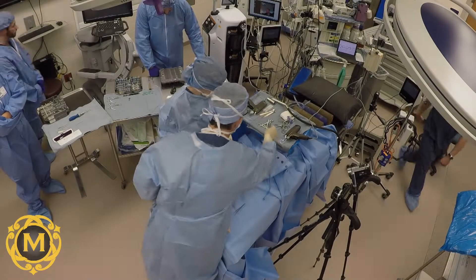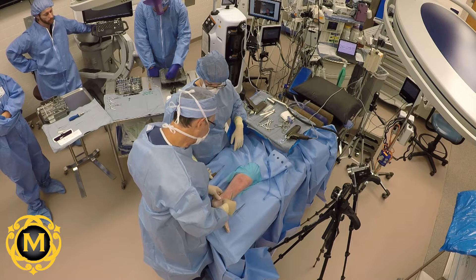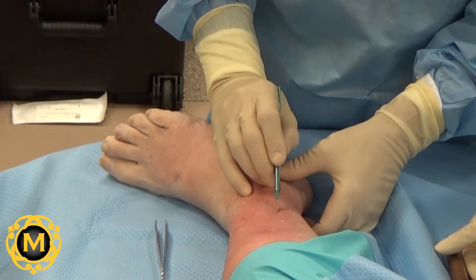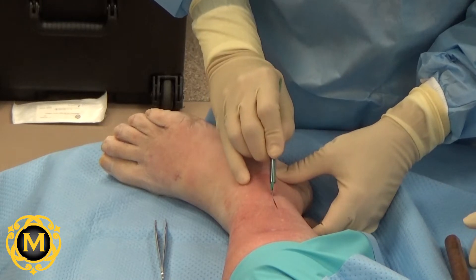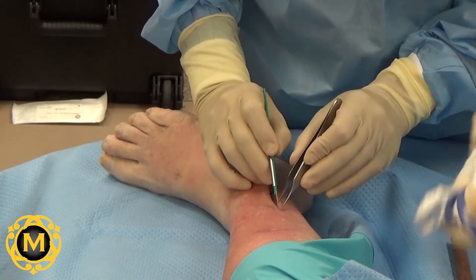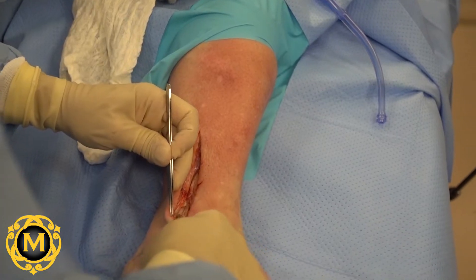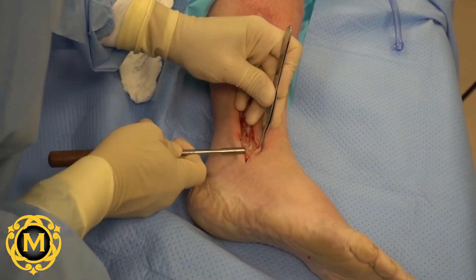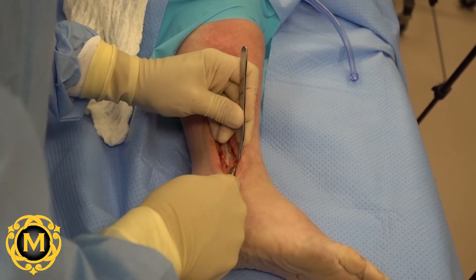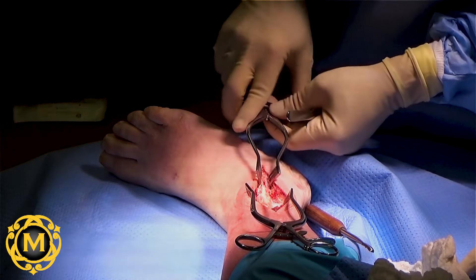The specimen was positioned in a left lateral decubitus position for maximum ease of approach to the lateral fibula. Anatomical defects, such as fracture, were not present nor were they created. An exaggerated incision was created to allow for maximum visibility during this filmed instructional procedure. Bony and soft tissue landmarks were identified. An approximately 6-inch longitudinal incision was made and sharp dissection was taken down to the level of bone. Soft tissues were removed from the bone, and skin and soft tissues were retracted for maximum visibility.